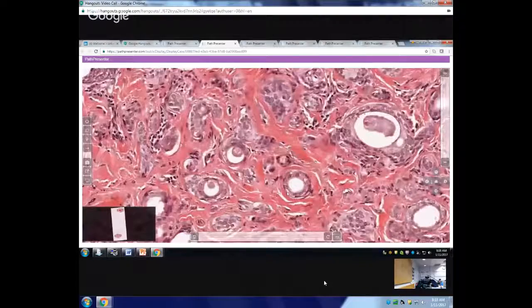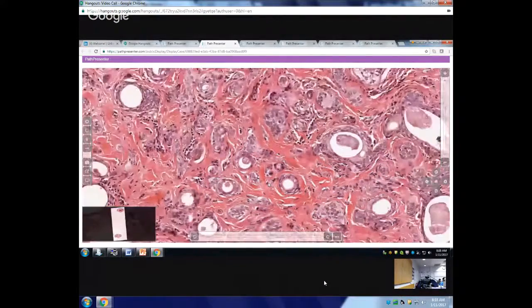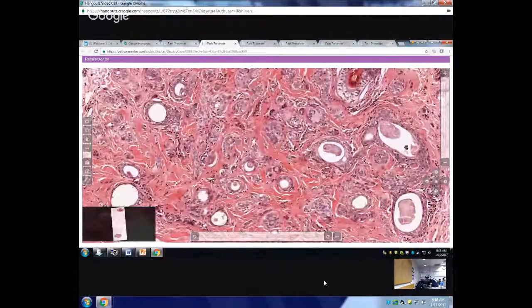So these are actual glandular structures, because eccrine is the eccrine duct and the eccrine gland. Yeah. That is actually a glandular structure. So you're going to see a collection of glands in a syringoma, but you don't see any keratocyst or hair cyst or anything like that. So these are actual glandular structures that you are going to see within the syringoma.